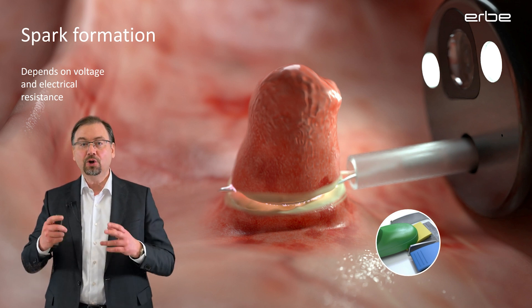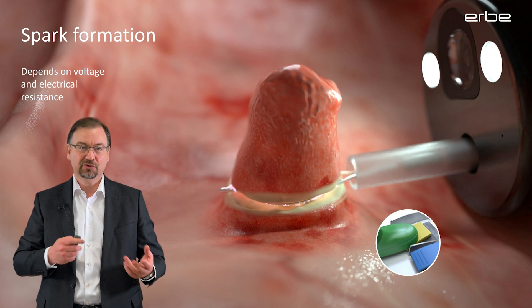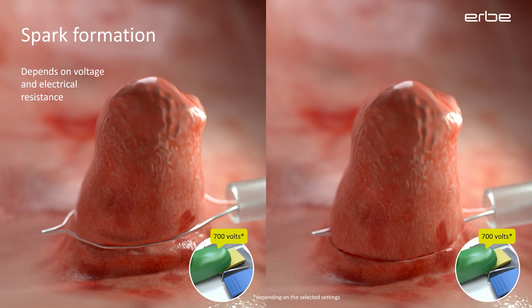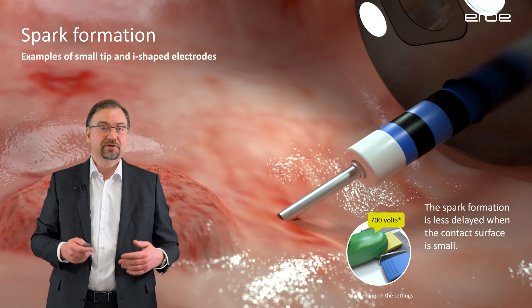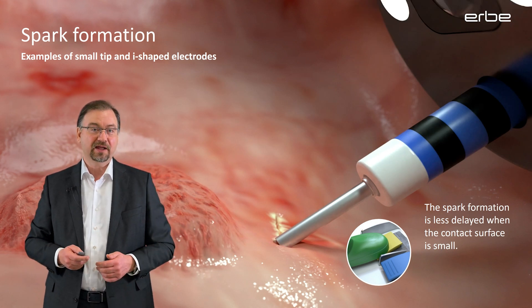The bigger the contact surface is, the longer this process takes. This explains why the incision on a larger polyp can be more difficult and delayed in comparison to a smaller polyp. Another reason for a delayed spark formation can be if you squeeze the polyp with a snare, because then the wire is completely embedded in the tissue and the contact surface is even bigger. The problem is that in this situation the current will continuously coagulate until eventually the coagulation might become too much before the actual cutting has even begun.